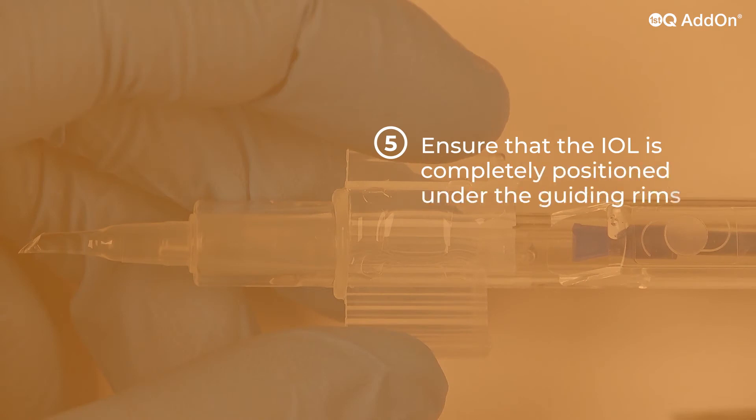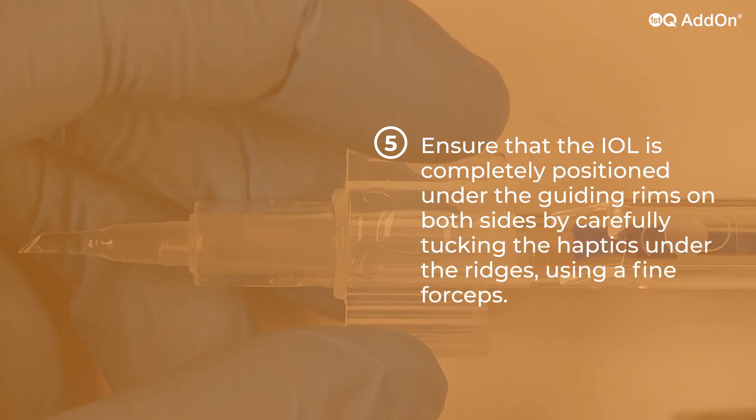Ensure that the IOL is completely positioned under the guiding rims on both sides by carefully tucking the haptics under the ridges using a fine forceps.